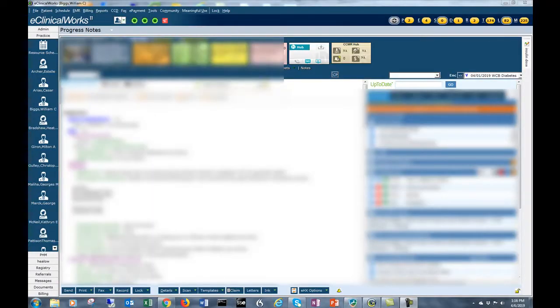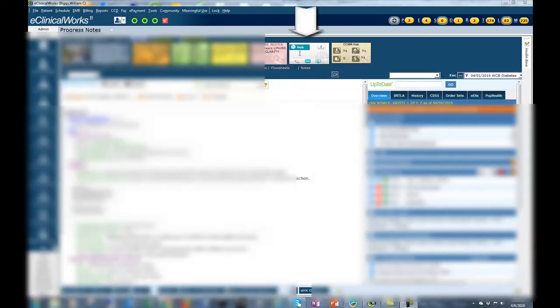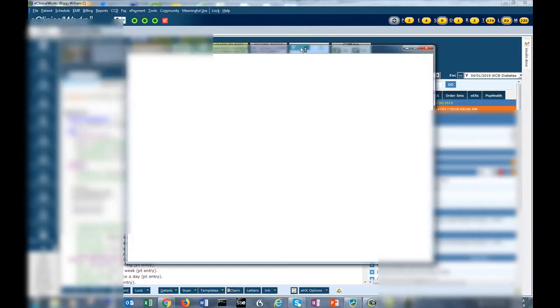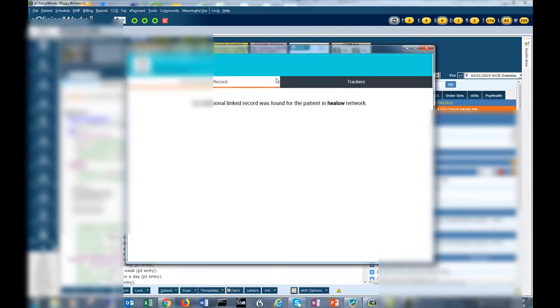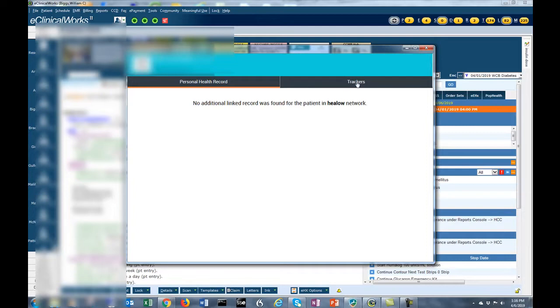We're going to start with the exe version. Find the Helo hub icon, which is in the center upper part of your progress note. You can use any progress note, even a progress note that's old and has been locked.